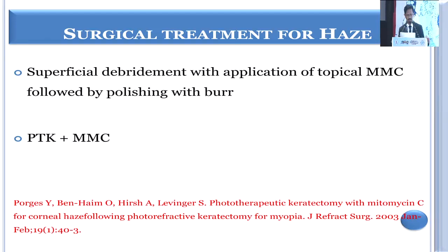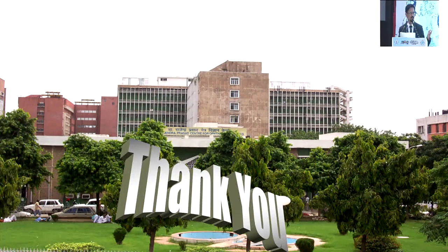It is variable with different people. I use it for 45 seconds if I'm doing a PRK, and if there is a haze, in order to treat that, I use it for 1 minute. That is what I do. So thank you very much.